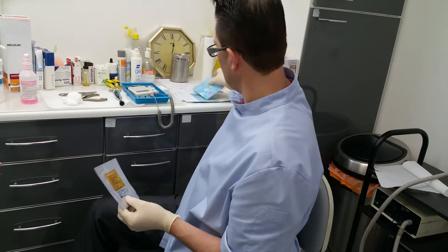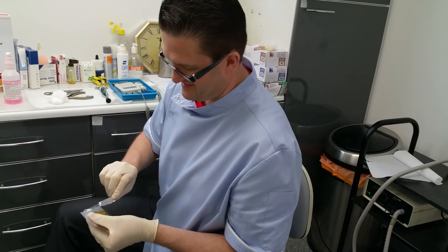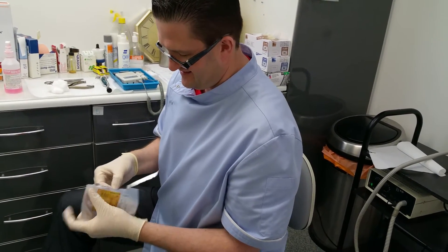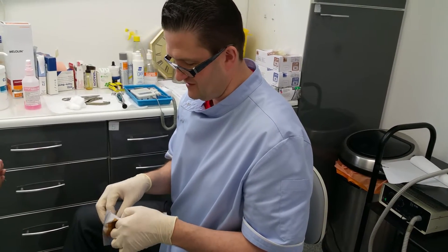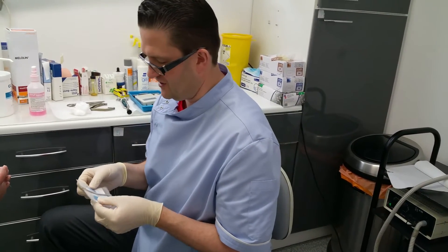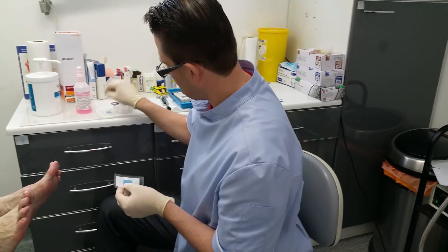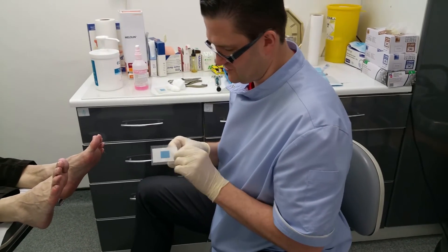So without further ado let me just tear open this packet here. This is actually really good because it's a test that people could do at home as well — you can actually purchase these and do them at home.